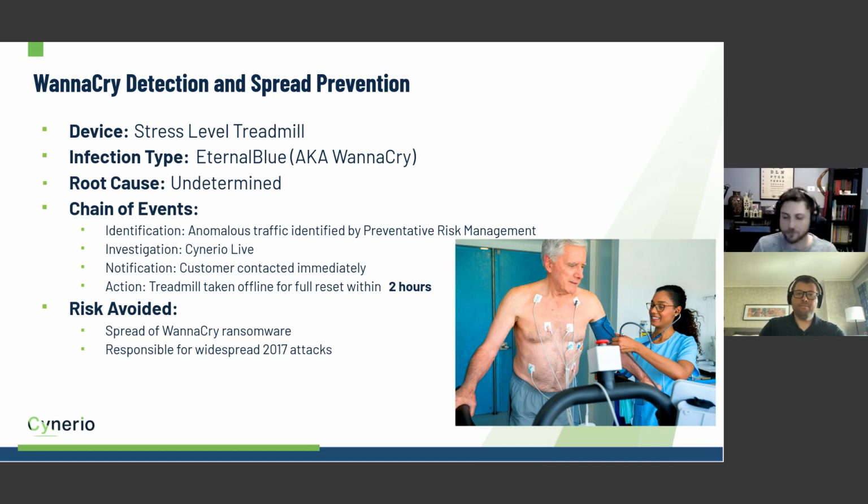We told them to run forensics on it, told them, of course, to quarantine it and not allow it on the network. Actually, it's never returned to the network as far as we can tell. So I think they might have just decided to decommission it, or maybe just get rid of it. This could be one of those examples of the kind of things we were talking about with operating system upgrades, where sometimes it's such a hassle to upgrade the operating system that it actually makes more sense to just sell the device or disconnect it from the network, or some other solution rather than upgrade the operating system.